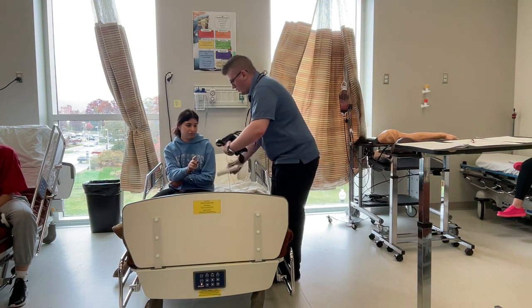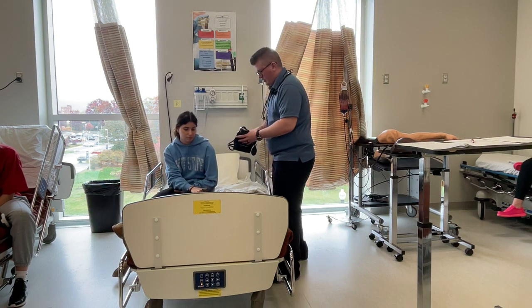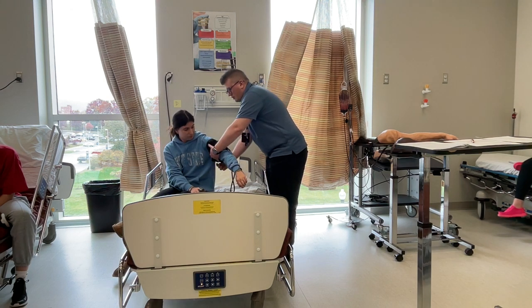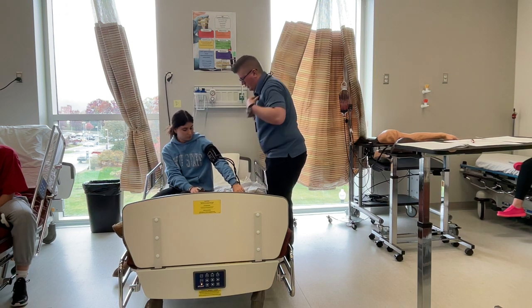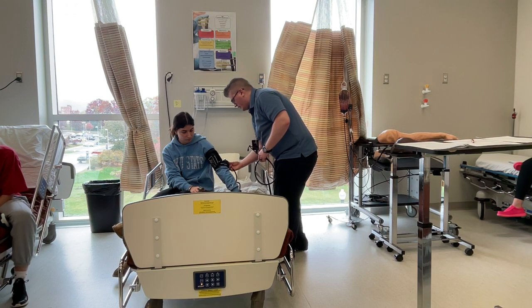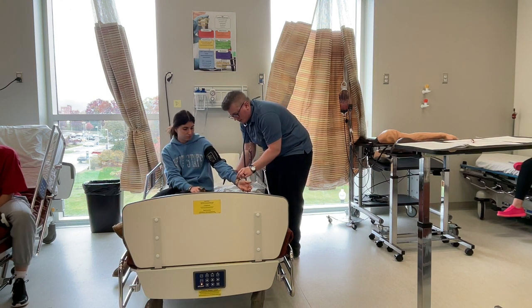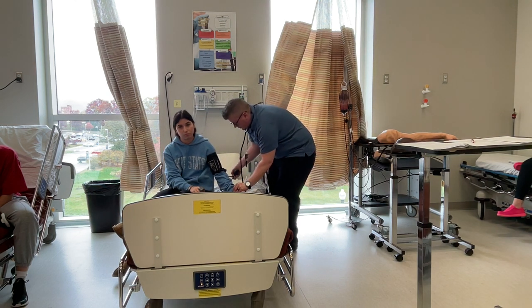Might just put this on any one of your fingers. Thank you. We would normally do this right on the skin, but for the purposes of this video, we're not going to do that today. So we're going to do a two-step blood pressure. So we're just going to clip this right here. And I'm just going to actually feel your radial pulse. I'm going to squeeze it until I don't feel it anymore. Perfect. Awesome. You can just relax on there.